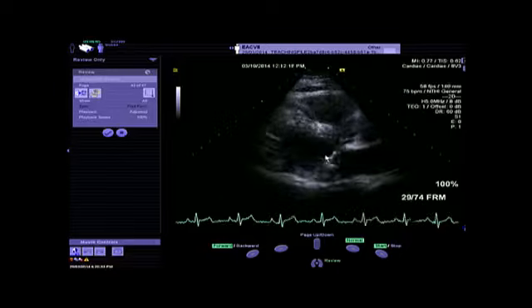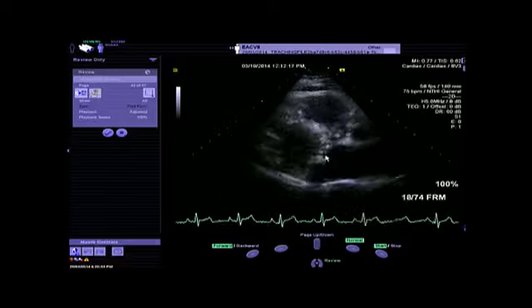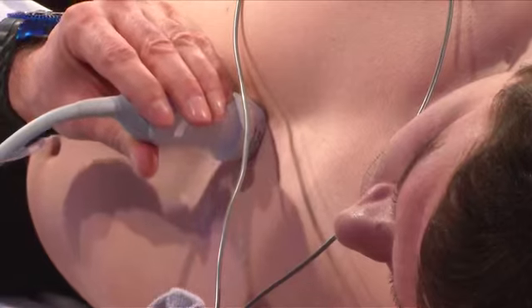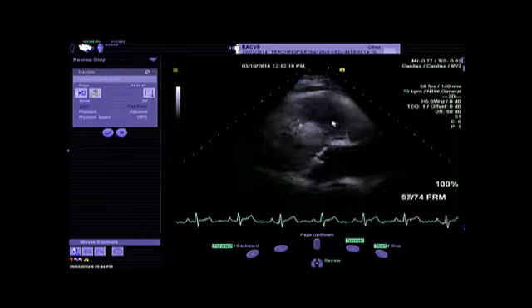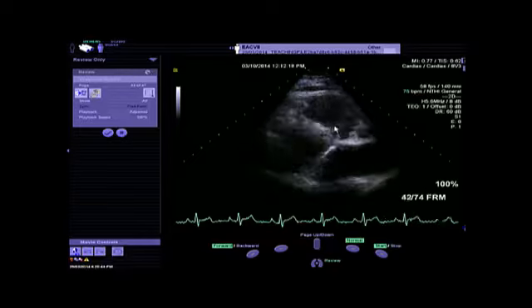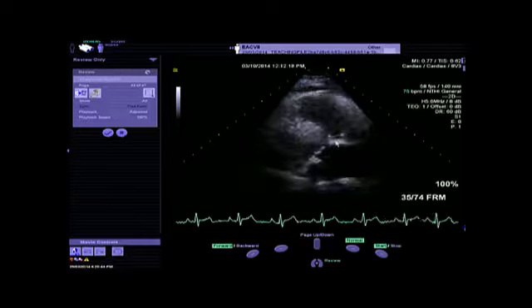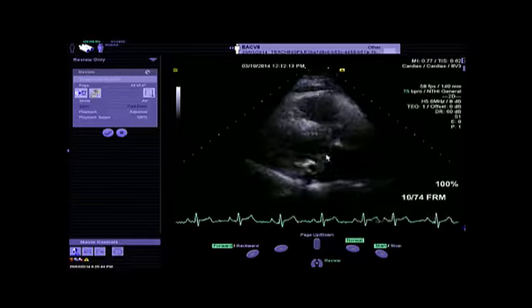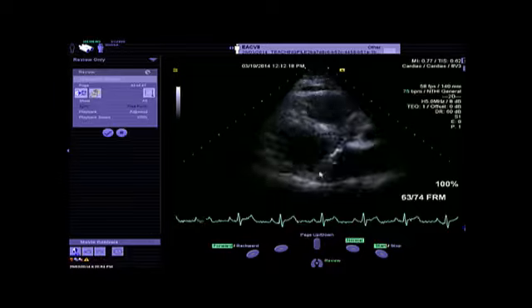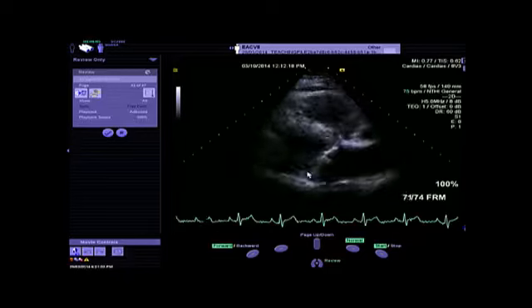And as you can see with my hand, I have just shifted a bit or tilted a bit the probe toward the tricuspid annulus, and it's difficult to be stable. And what we can see in this situation is mainly the examination of A1 and P1. And this is just in case you want also to see if there is any important prolapse of the P1 and A1.